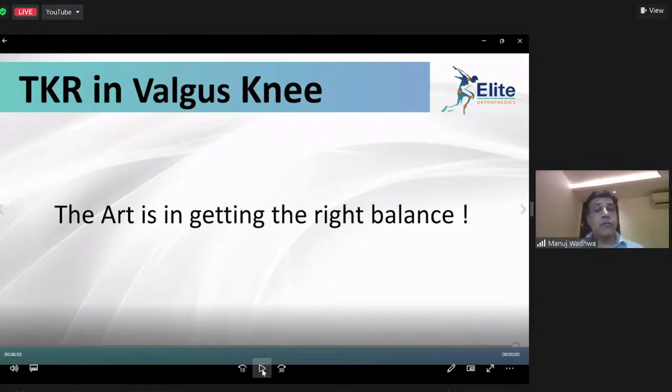Dr. Bariad likes a lot of lateral condylar osteotomies, and I can keep that as a very strong backup. Similarly, regarding what my dear friend Chandrasekhar is going to show you on the lateral approach, I use it only in cases where I have an already dislocated or subluxated lateral patella. Otherwise, all these steps are done by a medial parapatellar approach, and in almost 99% of the cases with a CR knee. With this, any questions, I'll be more than happy to answer.